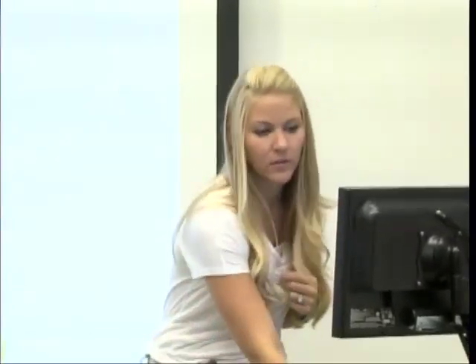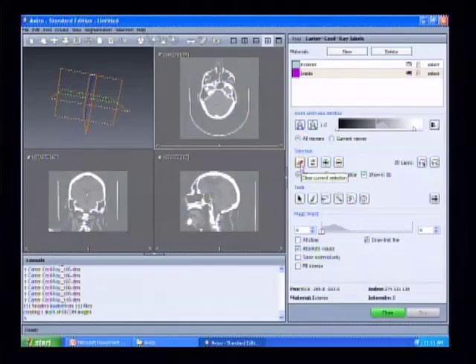So you have the clear button, which looks like an eraser. If you ever have anything selected, you'll see that it shows up in red, and if you don't want to use that, you can click the clear button and it'll undo your selection. Then you have this plus button and the minus button.